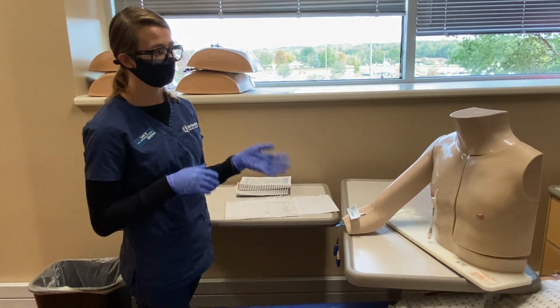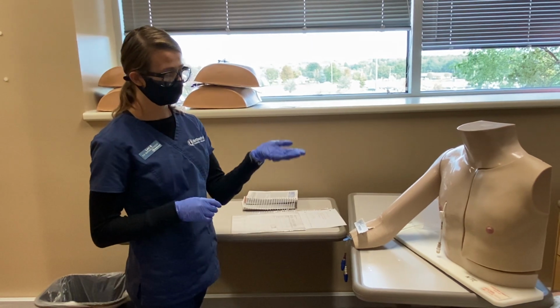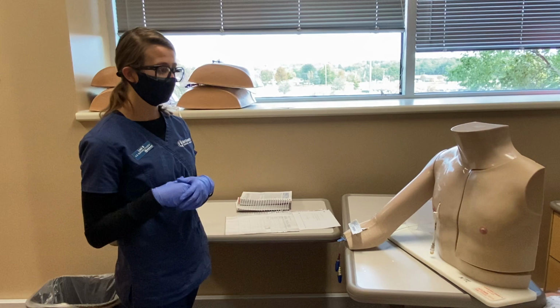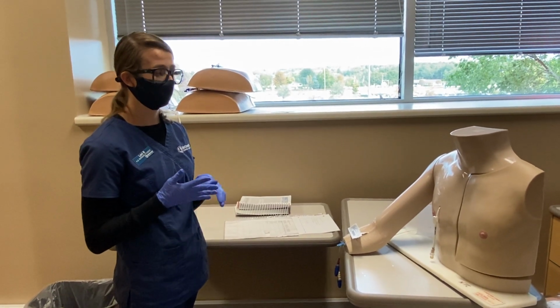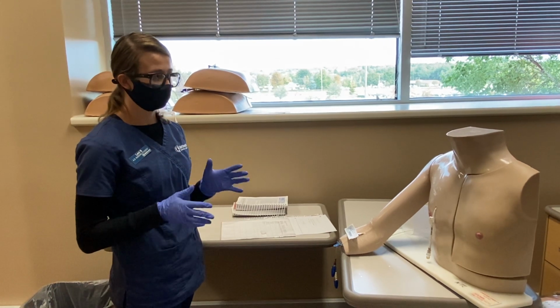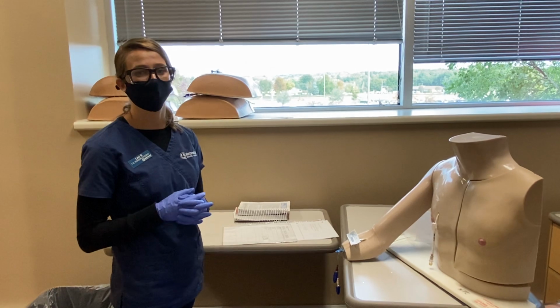I'm going to make sure he's in a safe position, hand him his call light, and then I'm going to document. I'm going to document my assessment findings of his IV site. I'm going to document what I gave, how much I gave, how he tolerated it, the time I gave it, and if any side effects happened, I would document that as well.